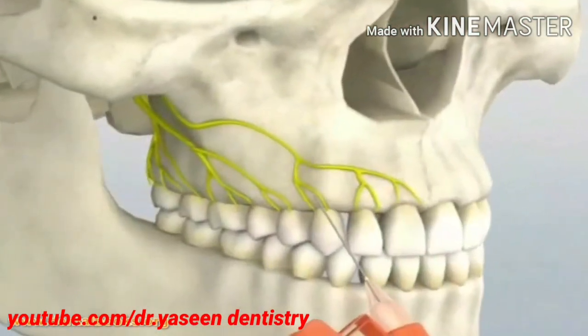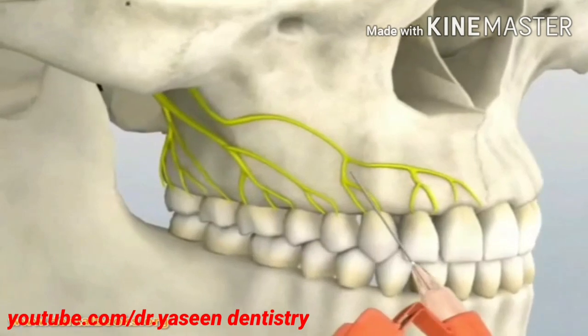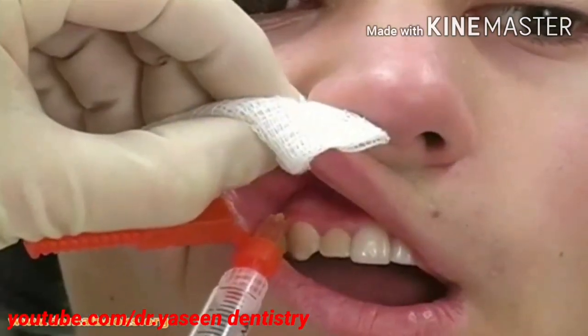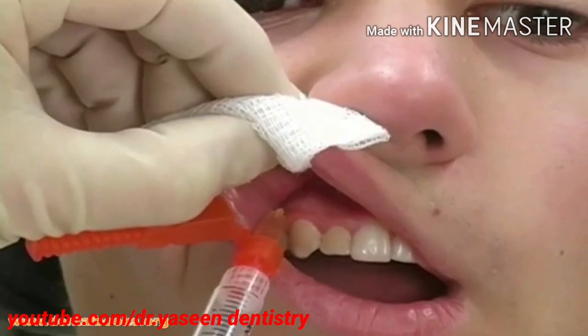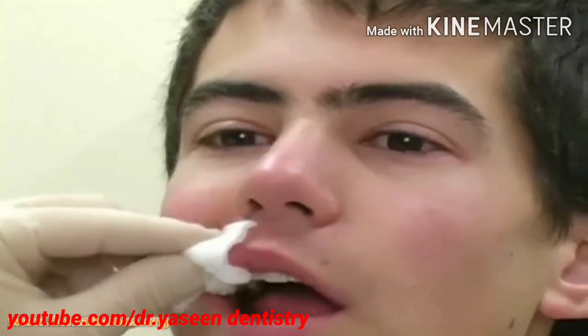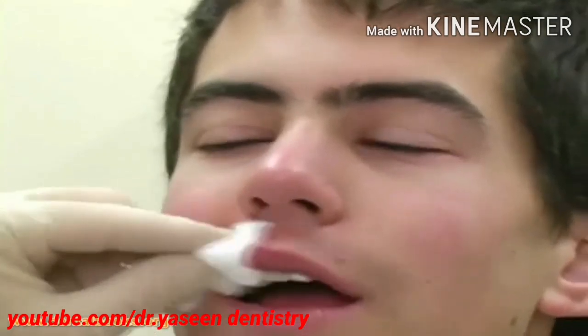Advance the needle superiorly at a 45-degree angle. Aspirate to exclude intravascular placement, and then inject 2 to 3 milliliters of anesthetic. Massage the area for 10 to 15 seconds to hasten the onset of anesthesia.